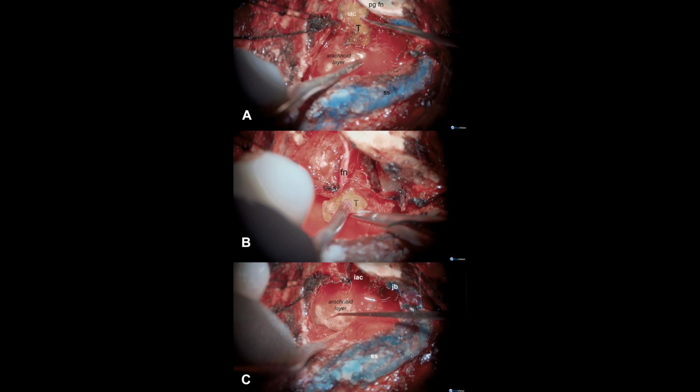If the nerve continues to stimulate normally, further gentle dissection may proceed. If thresholds rise or responses fade, signs of neuropraxia, the dissection should stop. At this point, more than 99% of the tumor volume has already been safely removed.